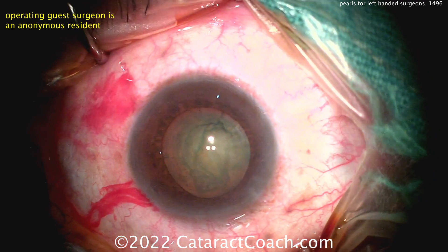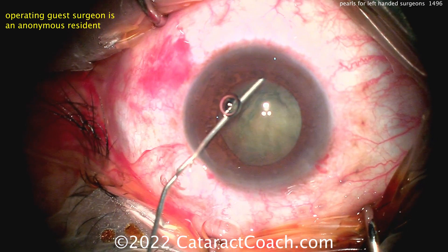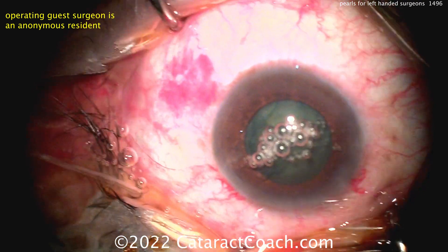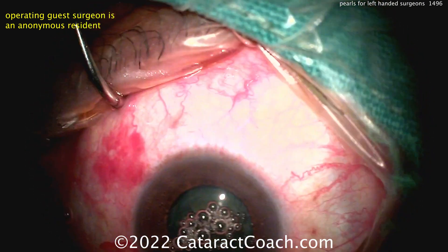This hammers home my point — you really should be able to do surgery with either hand. You should be able to use the FACO probe in your right hand if you're right-handed, but also your left hand for those cases where it's more useful. Similarly, you should be able to do a capsulorrhexis with both hands.